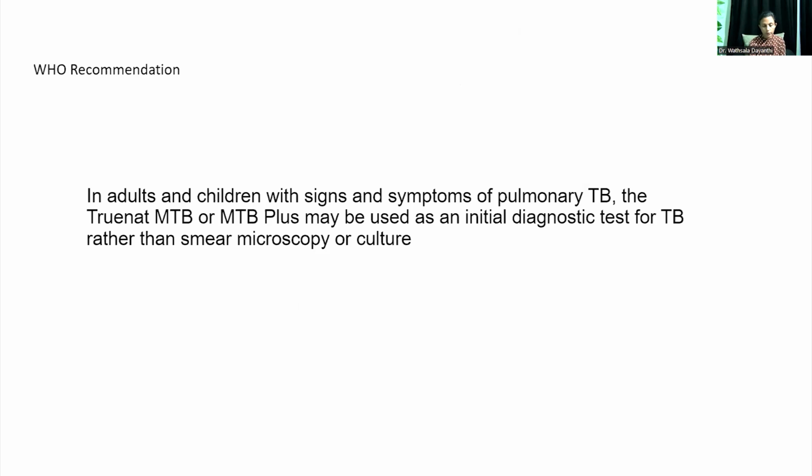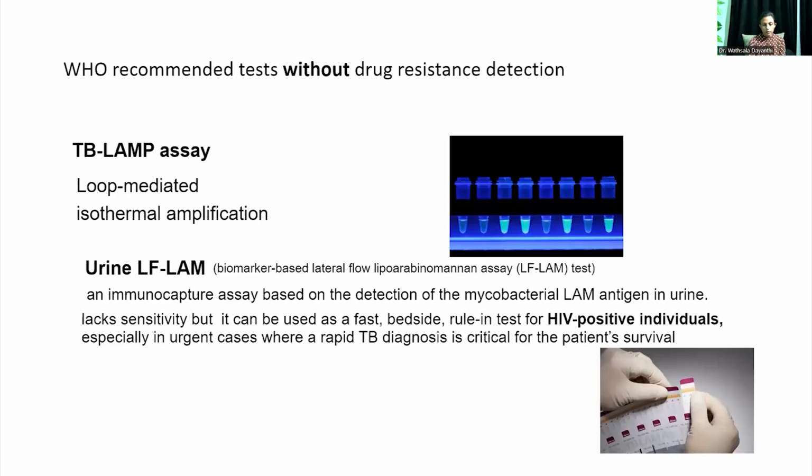So for TrueNat, the WHO recommendation is to use it as the initial diagnostic test for TB rather than smear microscopy or culture. So this is just for completeness' sake. Neither of these tests is available in Sri Lanka.